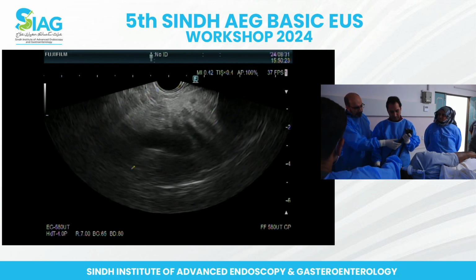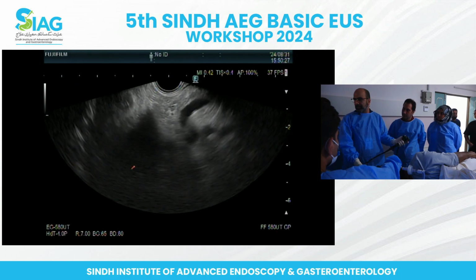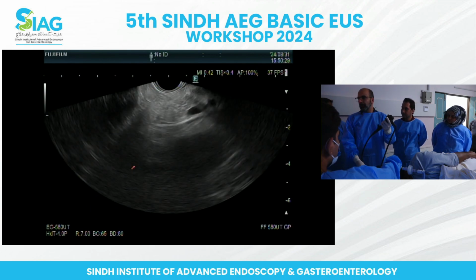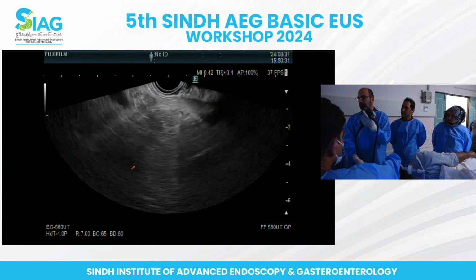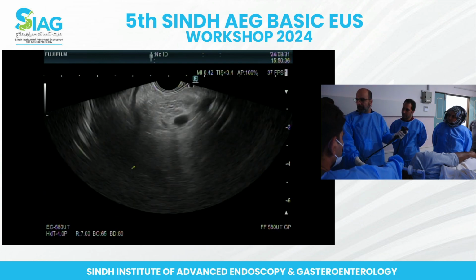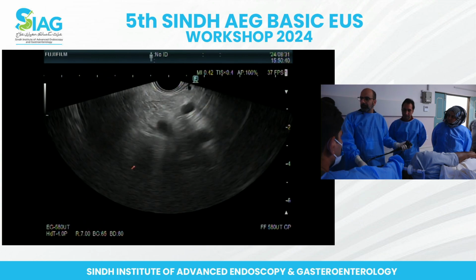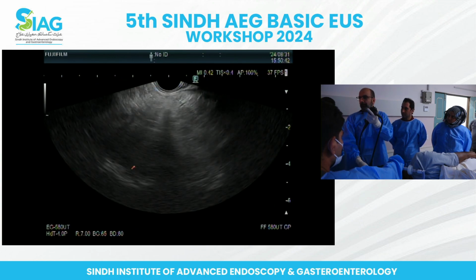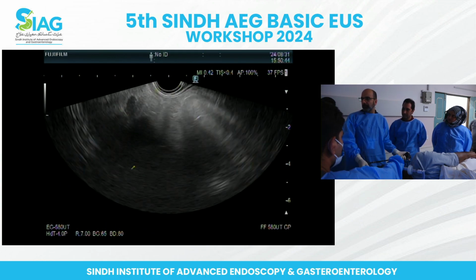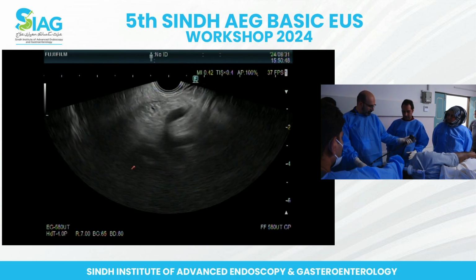Okay, but now what I want you to do is try and do all this a bit faster. So you just relax like this, go like this, follow it. So again, it's this left shoulder. I know it's repetitive, but this is the movement you want to see. You can see, in this one sweep, we're finding the PD, and I'm not doing much big wheel either, but we're following the PD going. So this is what you want to do, okay?